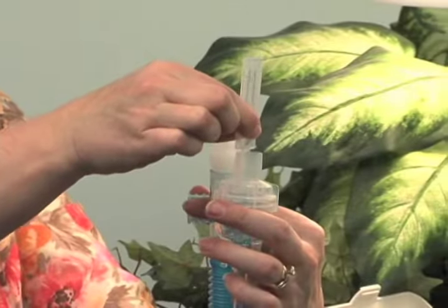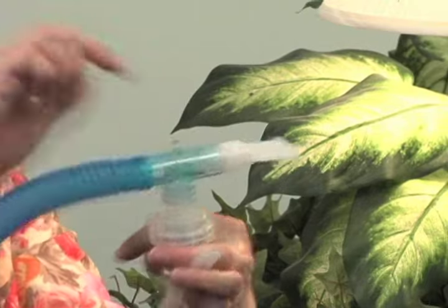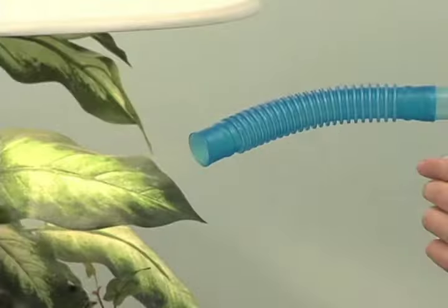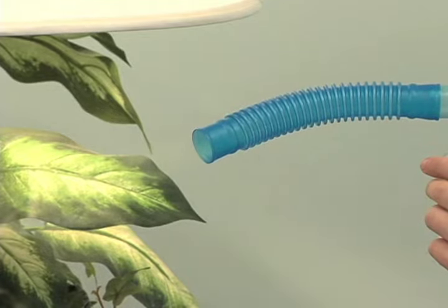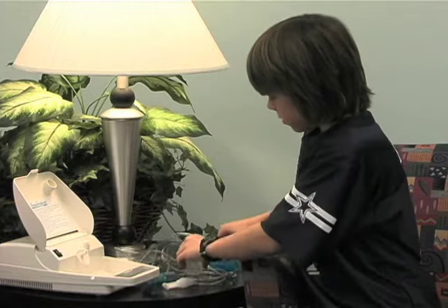Remove the T-piece assembly or mask and put the exact amount of medicine that the doctor has prescribed into the nebulizer cup. Replace the T-piece or mask. Turn on the compressor and make sure you can see a mist coming out of the mouthpiece or mask. There are two main ways to take nebulizer treatments.